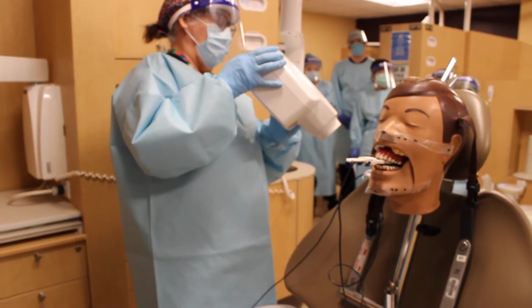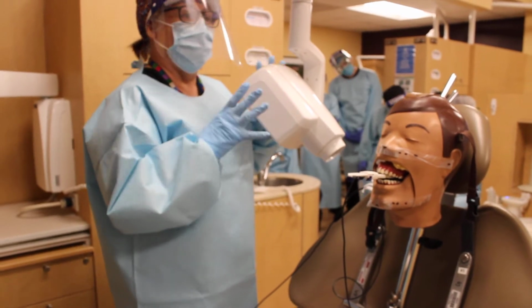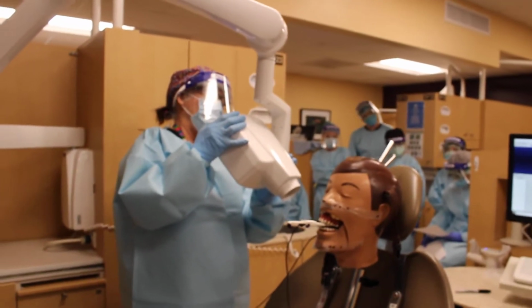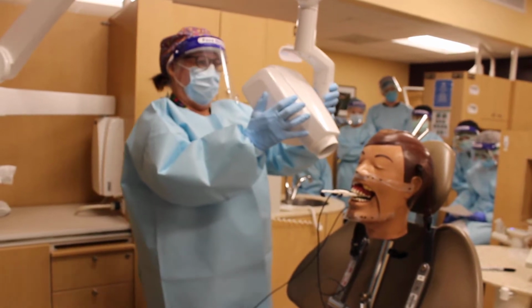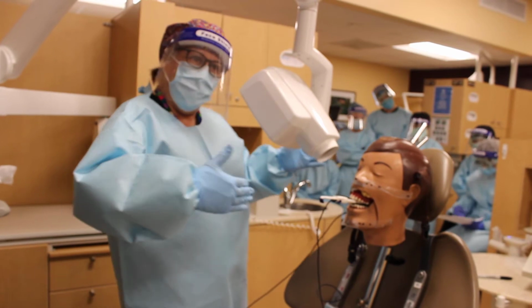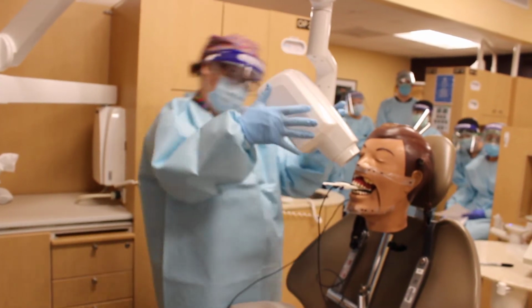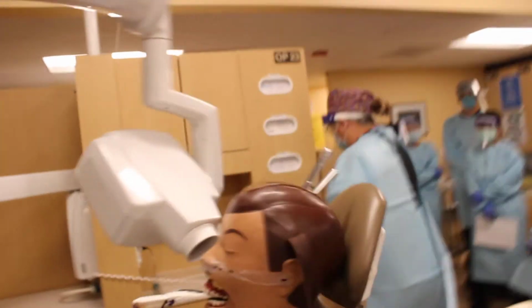So let's try 40. I don't change my angulation, which a lot of you are going to do. As soon as you start angling it, you're going to change your angulation. So let's try 40. Also, I'm not so far back. I'm going to change my horizontal a little bit, because now we start following the mouth. Let's try that.